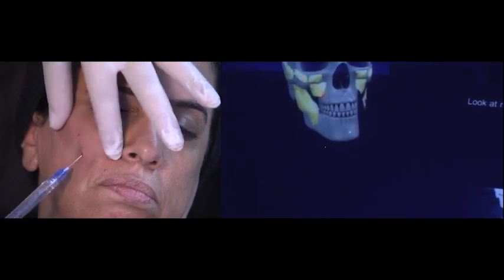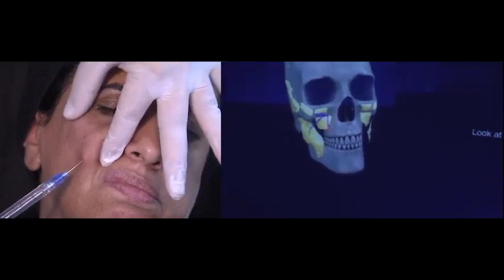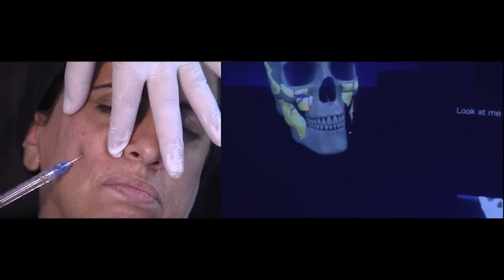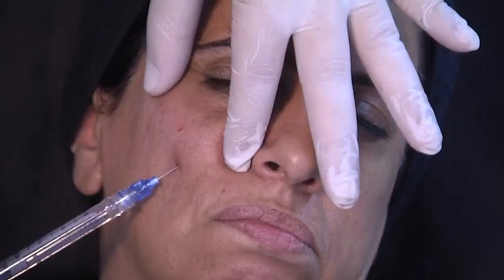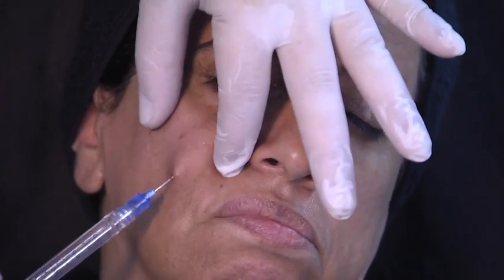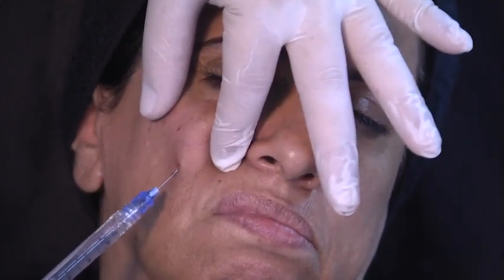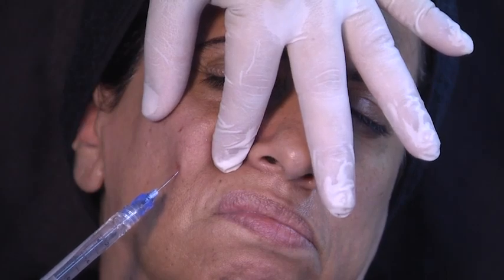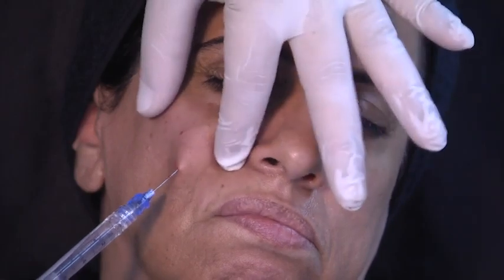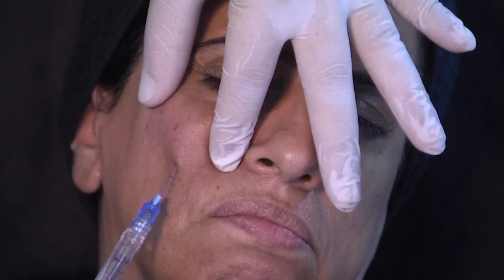Now look, again, I'm using all the time the same size of needles and cannulas. Now I want to go deep. To help me go deep, I pinch the skin, so I make sure that my cannula is in the deep plane. Look, I'm touching bone. And now I can do, first of all, my bolus, put my finger in the no-go area, and I start with a bolus because I want some projection as well, and I want some product to be in a bolus deposit.